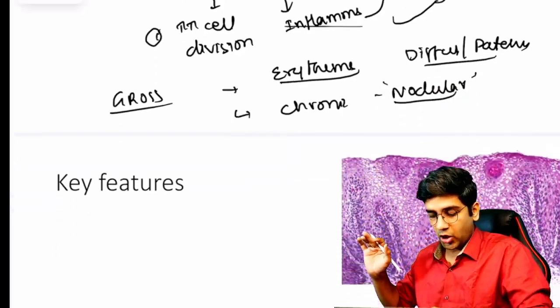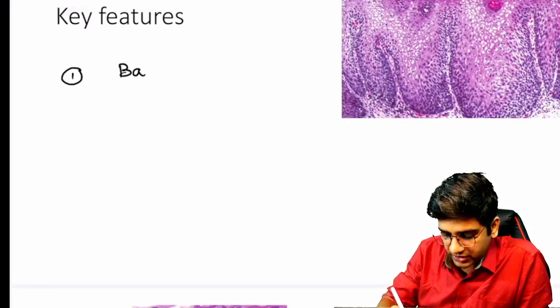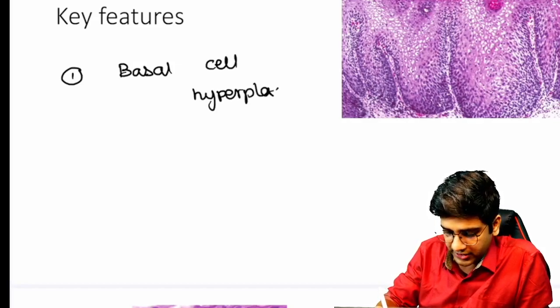Like I said, there are three things that are very important for me—three unique findings for GERD. All of them, like I said, are due to a reparative change. The first thing for me is basal cell hyperplasia. This is very unique. Basal cell hyperplasia is kind of diagnostic of GERD.